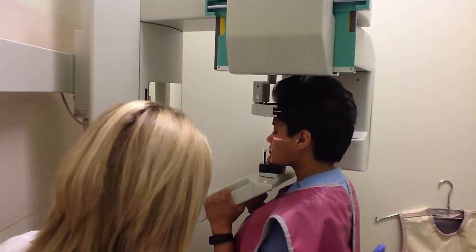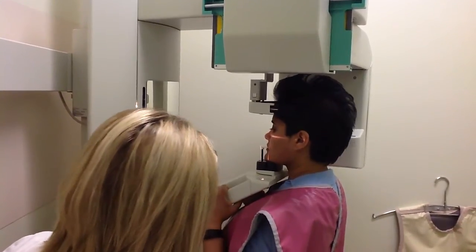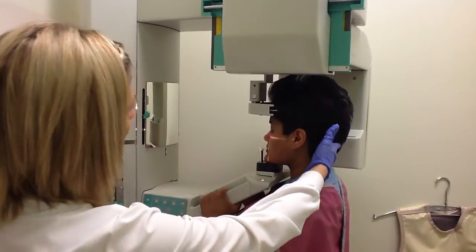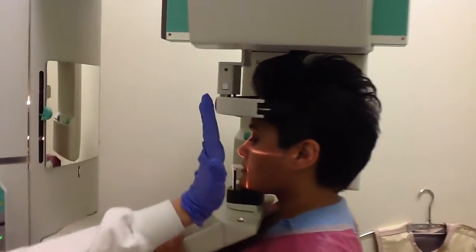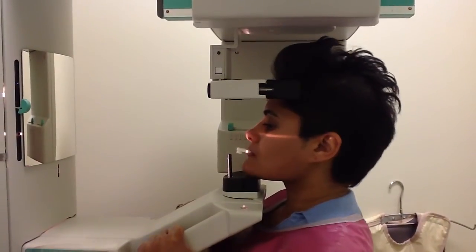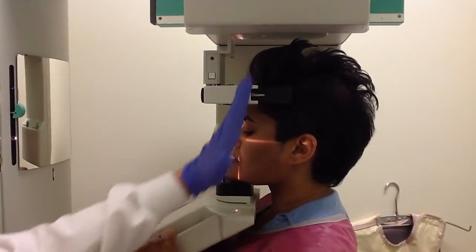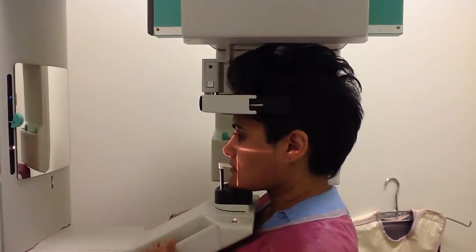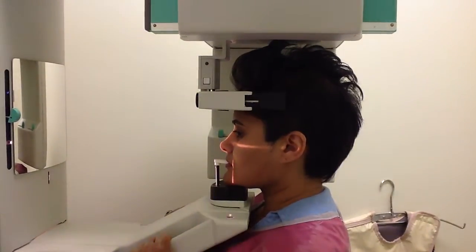At this point, I'm going to have the patient step forward again to help with the spine, stretching it out a bit, and keeping the patient really standing tall. Great, good job. So now we're going to look at the profile of the patient's face. We want this to be perpendicular to the floor. So again, for an example, if it was too high, you could see, whoop, that happens. And you could see Fareen's face is at an angle, tipped back. And if it's too low, you can see that she's at this angle. So we want it right straight, perpendicular to the floor.